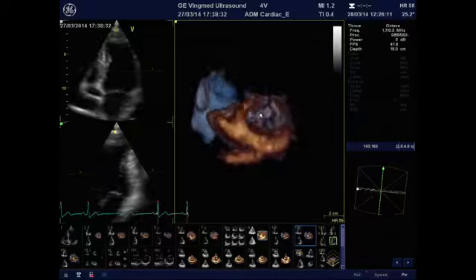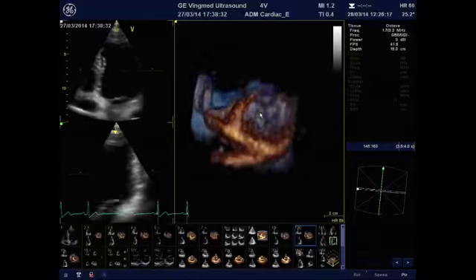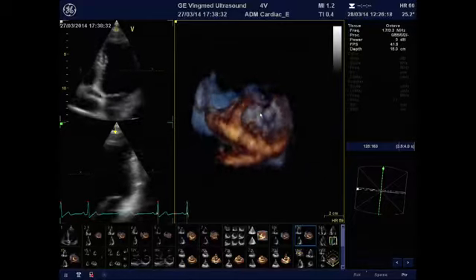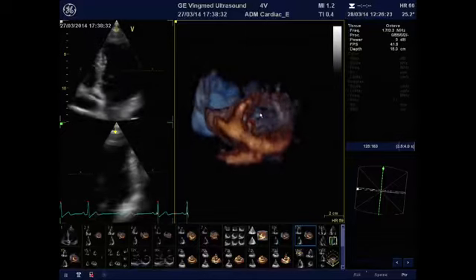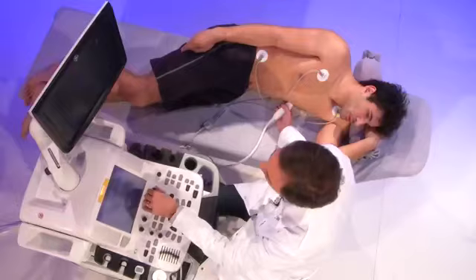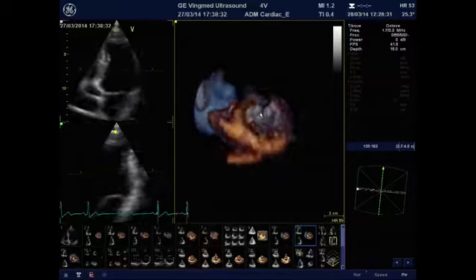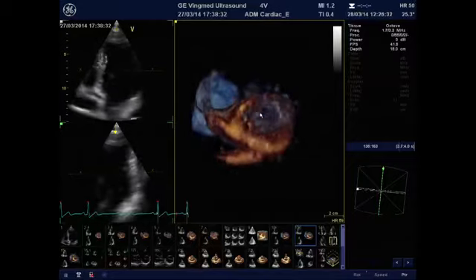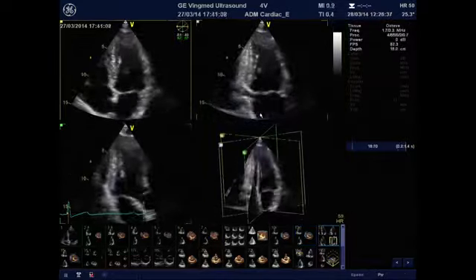And of course, it's very important, if you want to assess, for example, an interventricular communication, not to create it just by decreasing the gain. So usually we use only focus examination on top of 2D. It's very difficult to have a complete 3D examination. And you can focus first on the left ventricle.